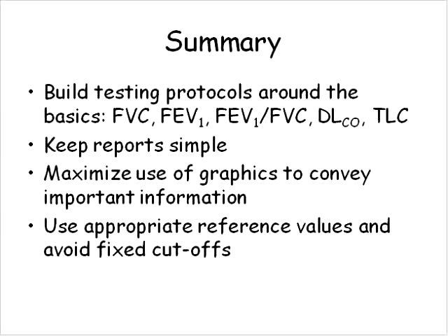Again, that ratio supposedly will help you decide whether or not there's a decreased flow during the inspiratory part of the maneuver compared to flow during exhalation. And I think it's much simpler and much more appropriate to convey that information as a flow volume curve, keeping in mind that you have to make sure that you select the inspiratory part of the flow volume display that reflects what the patient's actually capable of doing. And so just accepting the inspiratory loop that accompanied the best expiratory maneuver may not always be the most appropriate display of that information.